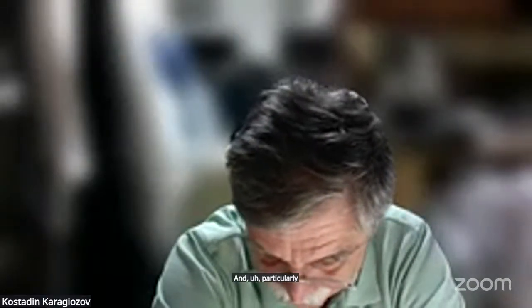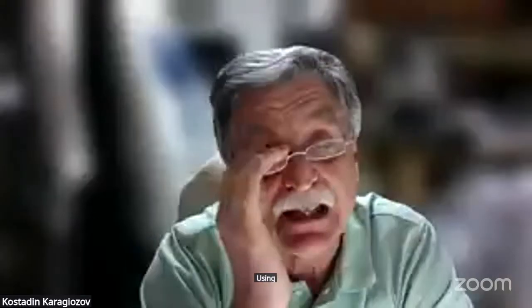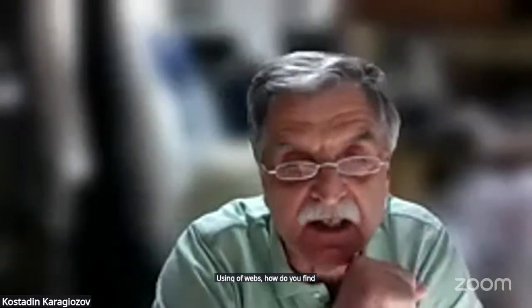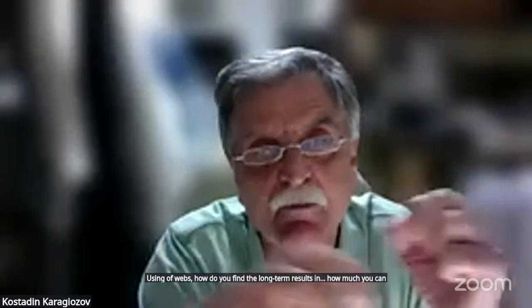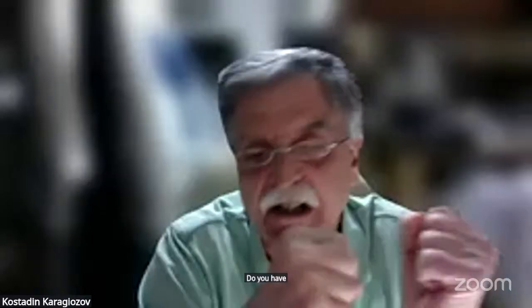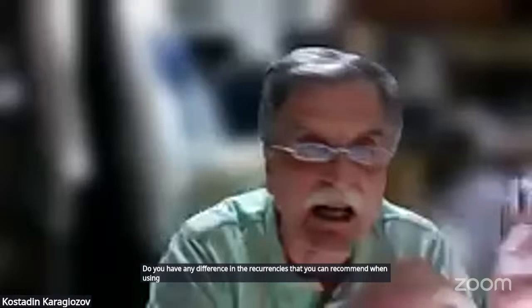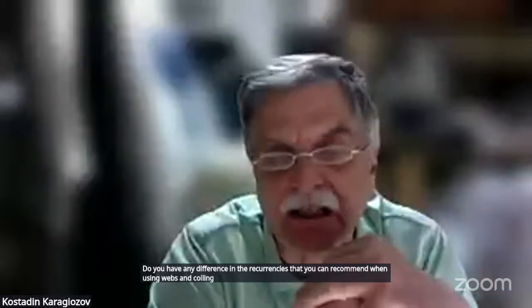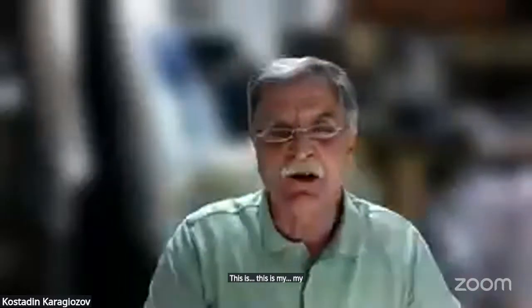And particularly the intrasaccular part, using webs, how do you find the long-term results and how flexible can you be in the selection of web? Do you have any difference in the recurrences that you can recommend when using webs and coiling, particularly techniques in these locations? This is my comment, and thank you for the long talk.